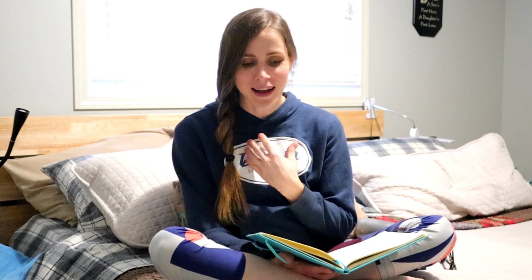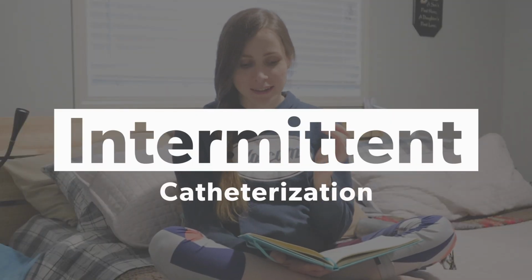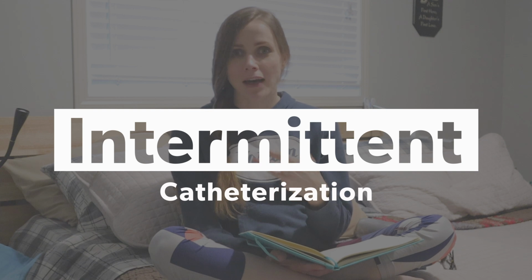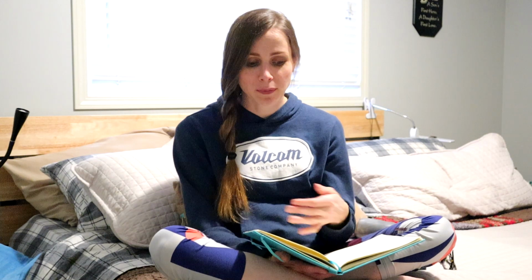Okay, let's get started with number 1. And that is the way that I learned how to pee after I was paralyzed, and that is intermittent catheterization. So intermittent catheterization is basically just inserting a catheter into your bladder using your urethra each time you have to pee. So hopefully you're using a clean catheter every time. Not everybody does that. Some people reuse catheters and wash them, but generally you're using a different catheter each time you go to the bathroom and you're inserting into your bladder through your urethra.